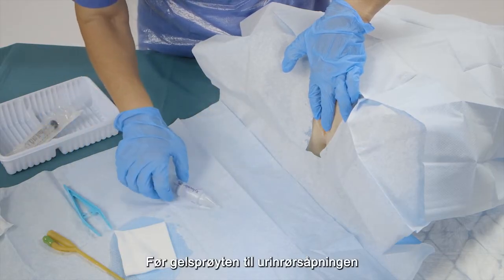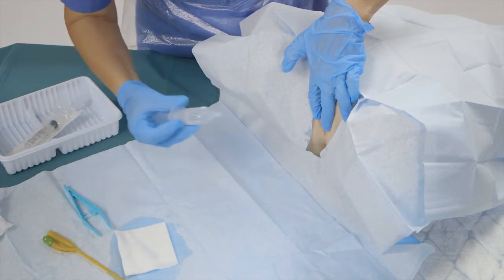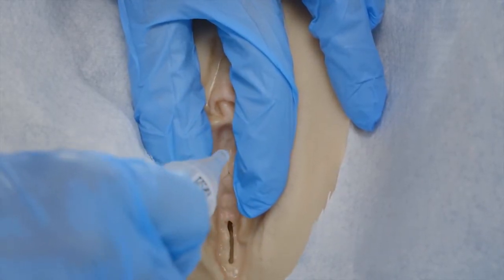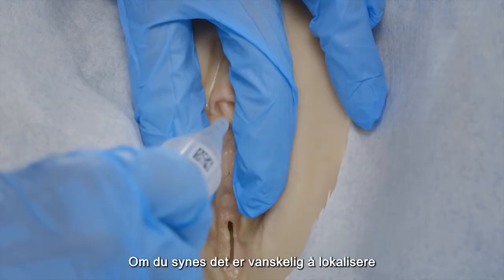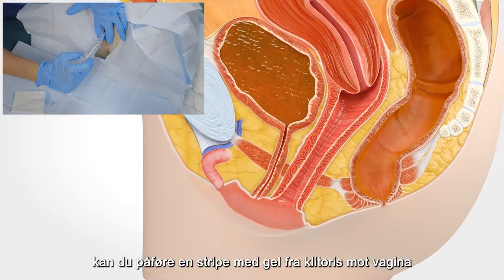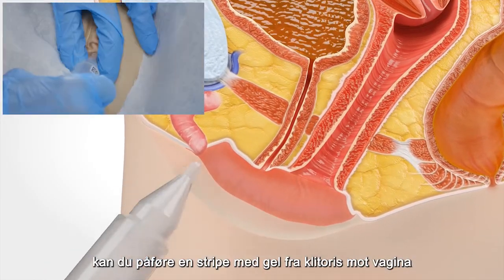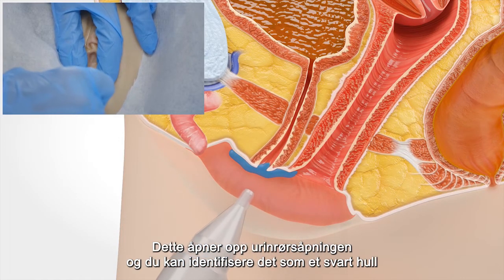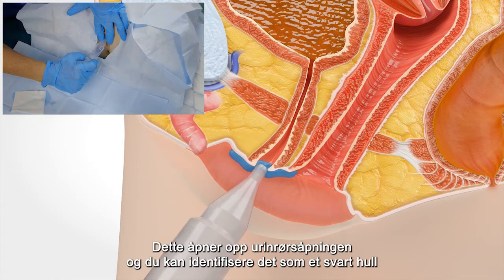Bring the gel tube to the urethral opening. If you find it difficult to localize, you can put a string of gel from the clitoris towards the vagina. This opens up the urethral opening and you can identify it as a small black hole.